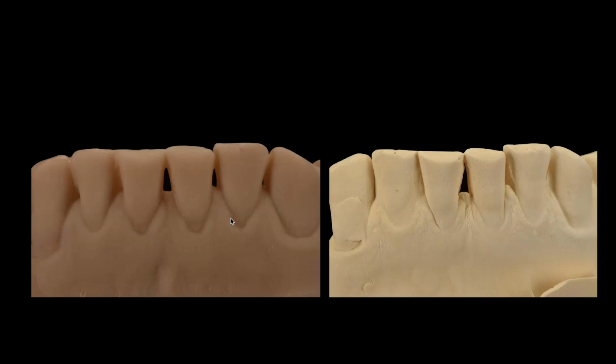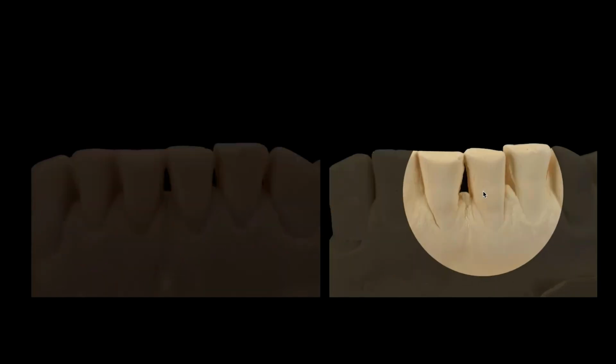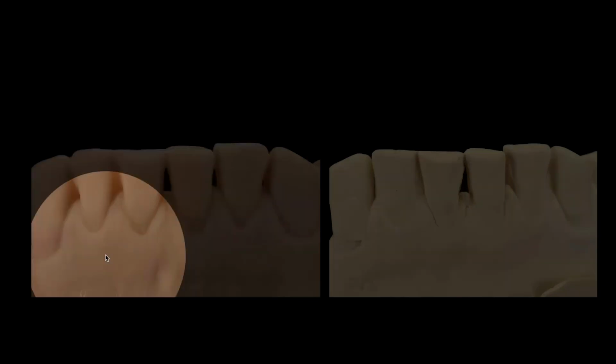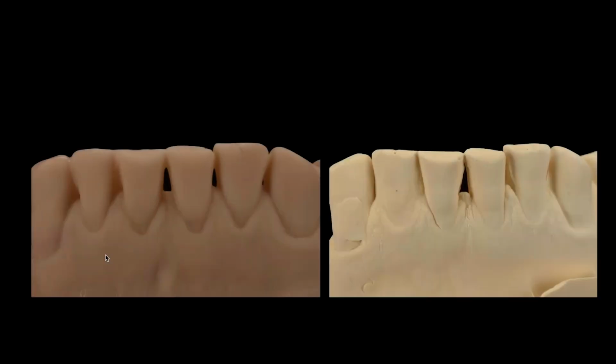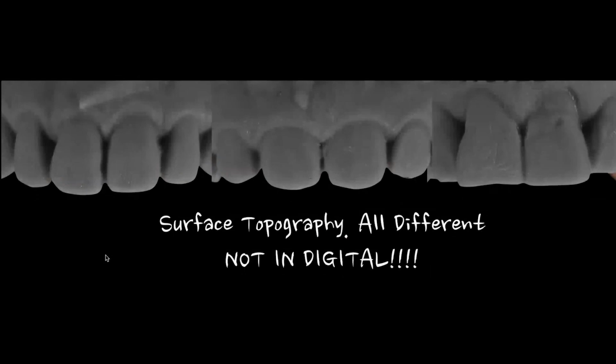Again, I'm not anti-digital. I just want you to notice the difference between a digital cast that I see here and a poured cast. You should be able to tell right away: look at the little horizontal ridges and grooves that happen here on these teeth, and look at what happens here. I don't see any of those. I don't see them because they don't really exist in a digital cast. A digital surface texture is all those little fake perikymata that are formed during the printing of the cast or the milling of the cast today.